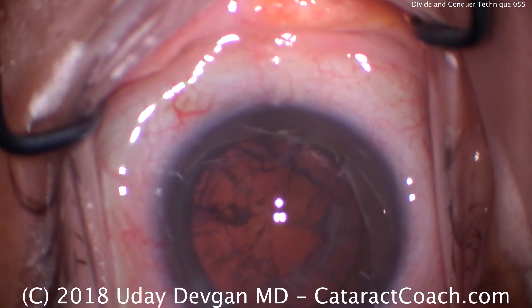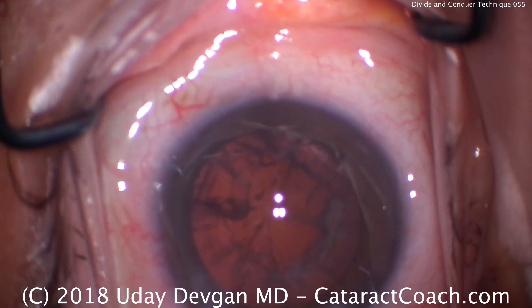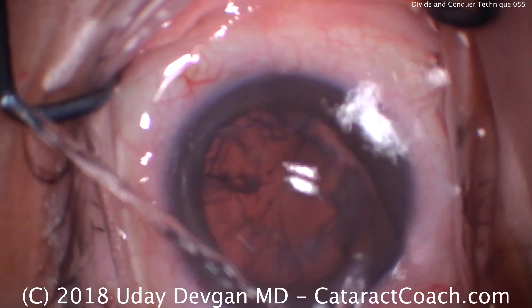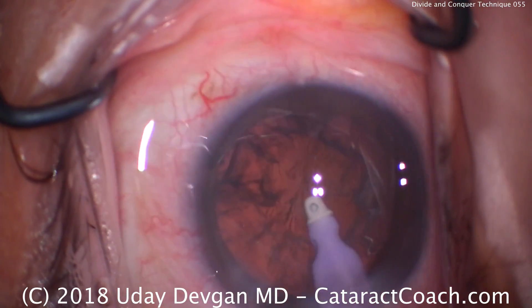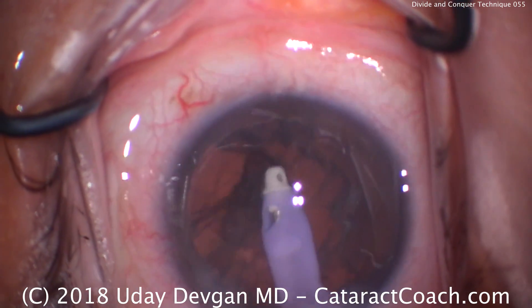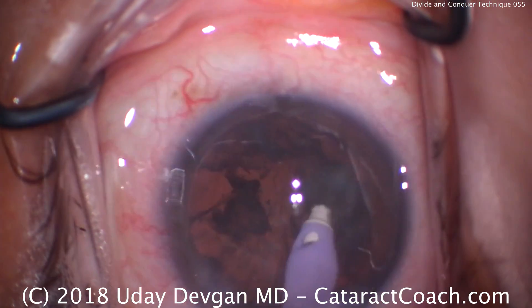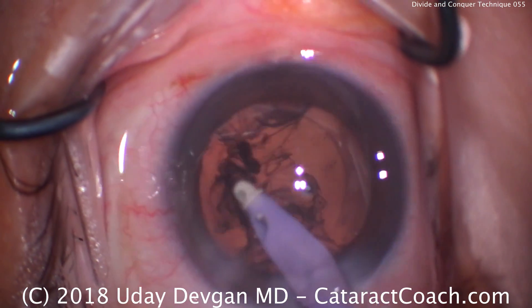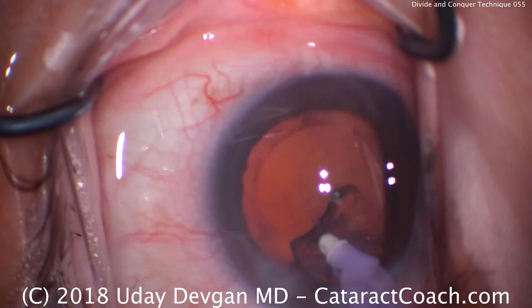This video is also shown in real time and unedited, start to finish — there are no cuts here, so you can watch the procedure exactly as it happens. For cortex removal, again try a circumferential manner, grabbing under the rhexis edge for at least a couple of clock hours and then moving it circumferentially, and we'll clean that up very nicely.